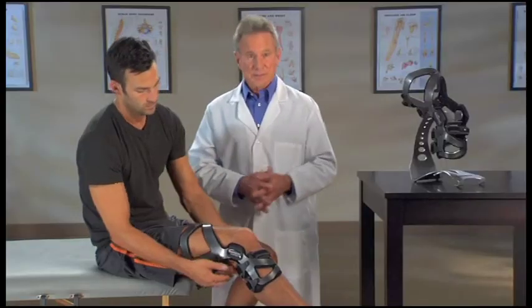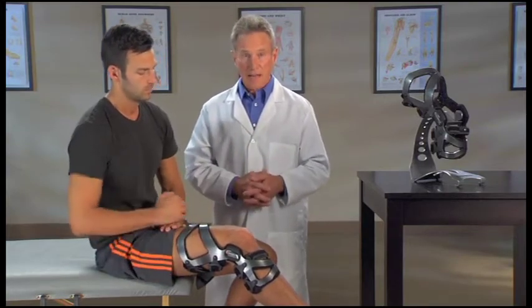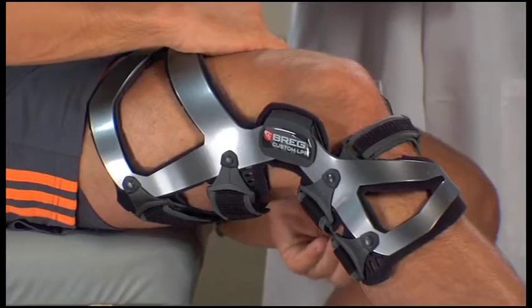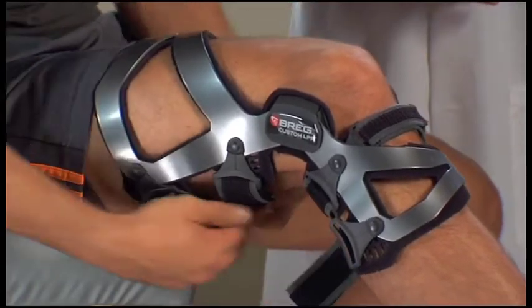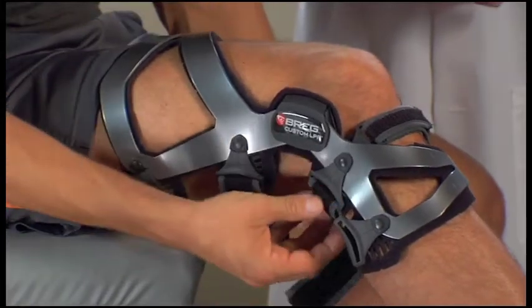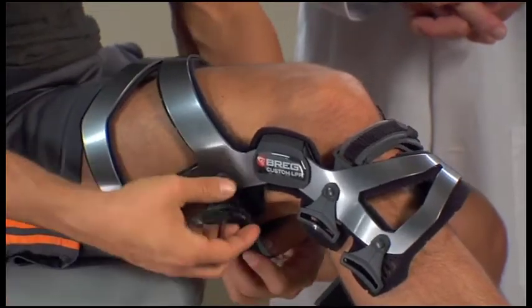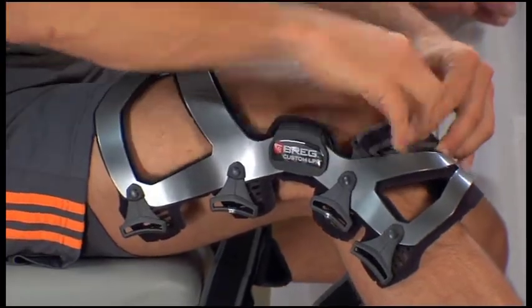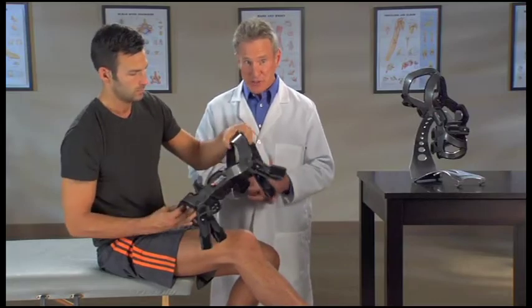For PCL specific applications, apply all of the back straps first and the front straps last. To remove the brace, unfasten all the straps but just loosen strap number three. Then remove the brace and fold the hook loop tabs back against the straps for easy storage.